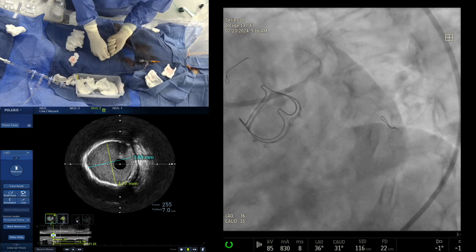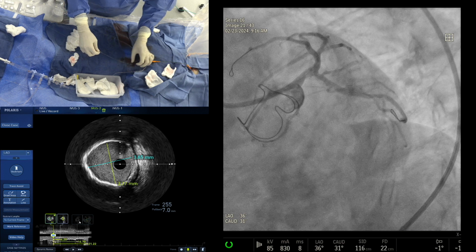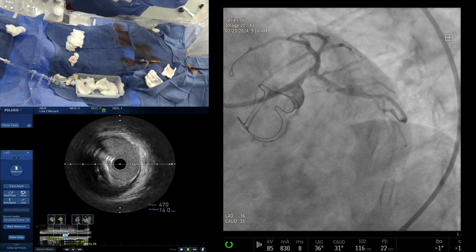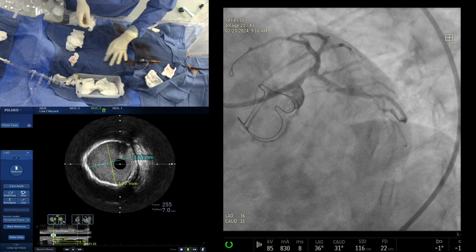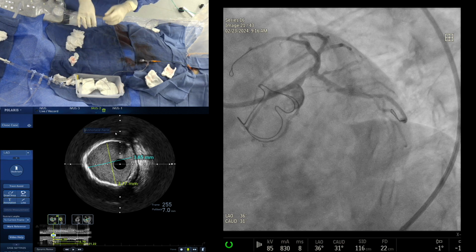Dr. Samin, why are you not going for a left main to circumflex and then LAD later? That's a very good point. Once we decided we are going to use a two-stent approach, clearly the LAD is the bigger vessel, so we'll put that as the main vessel and the circumflex as a side branch. Then with that approach, the question is the stent size and length we actually have.